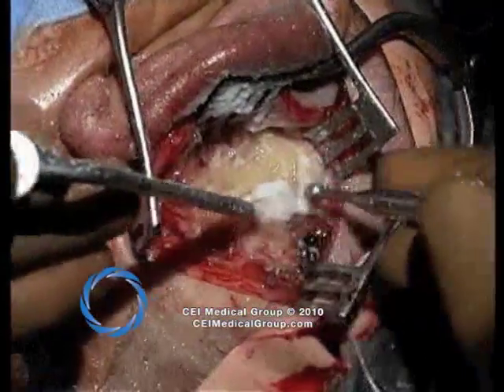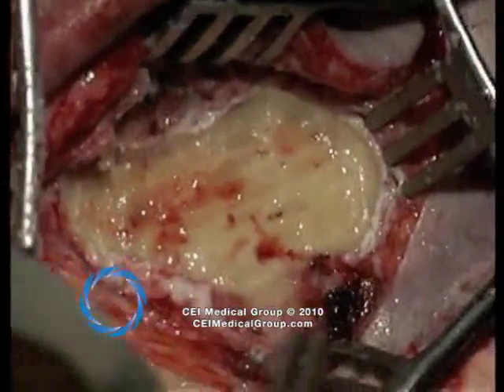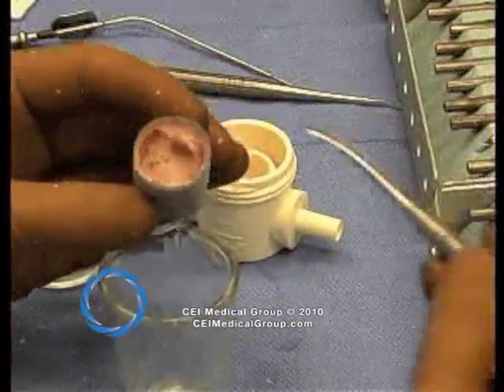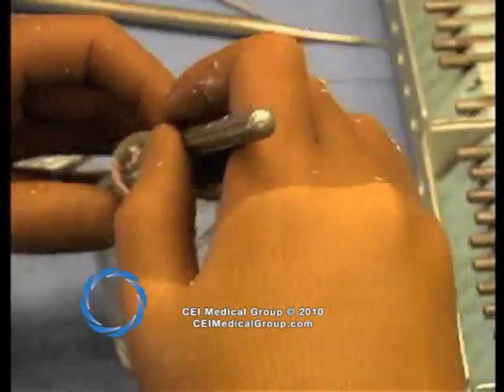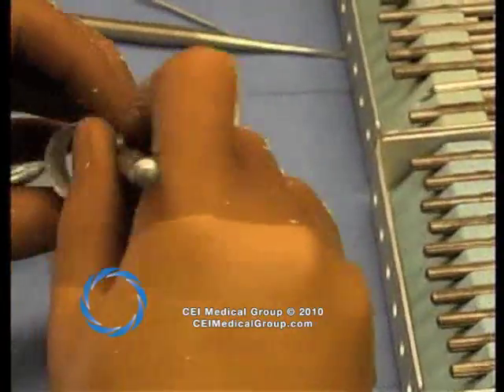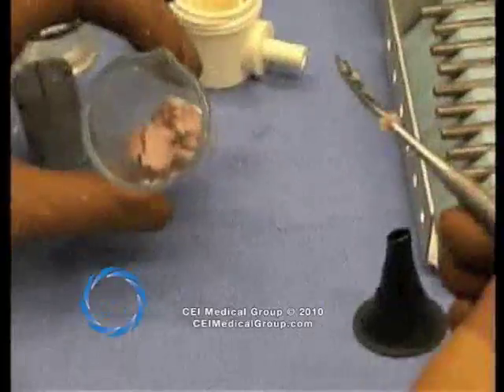We also recommend that bone pate be taken only from the sterile wound and not be removed from the surface of the skin or the drapes surrounding the patient. Once the screen is removed, the pate is then collected and placed within a sterile medicine cup. You will need approximately 15 cc's of pate to complete the procedure. This should be kept moist and covered until its use later in the procedure.